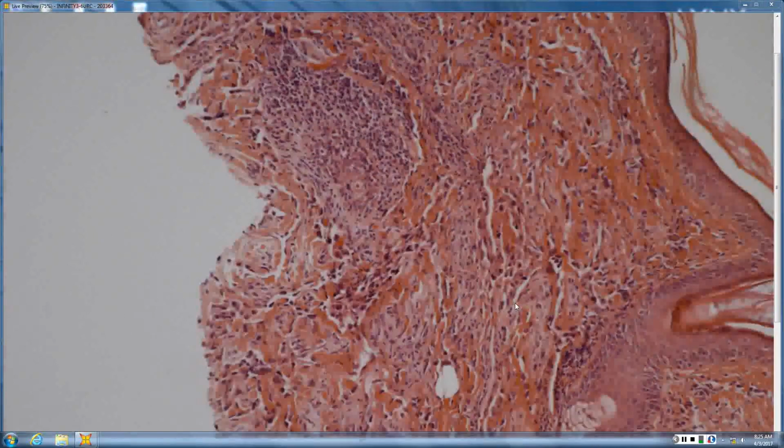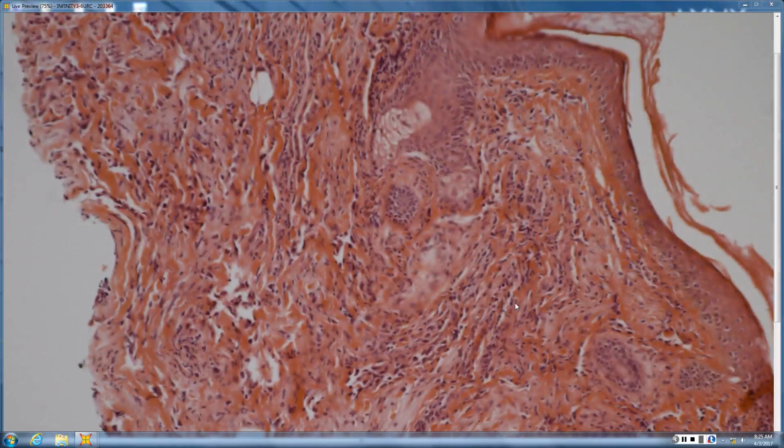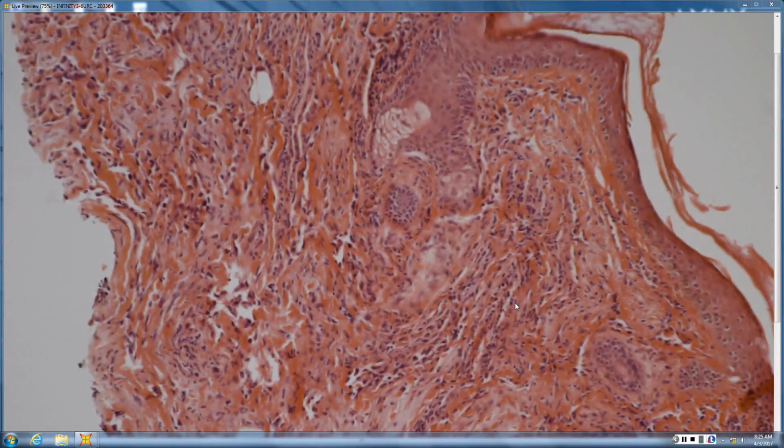Just a bunch of slit-like spaces there, not a lot of red cells, all through the collagen. Some nuclear atypia, it seems like to me. I would say think about patch KS. So does patch KS tend to have a lot of nuclear atypia? No, it's like some of the angiosarcoma. So more like angiosarcoma, correct. So high-grade nuclear atypia or solar elastosis, those all might be hints that it's more angiosarcoma.